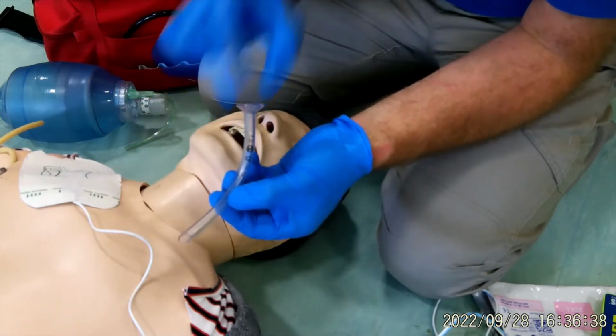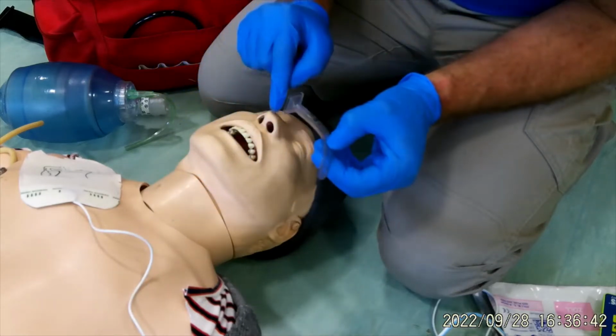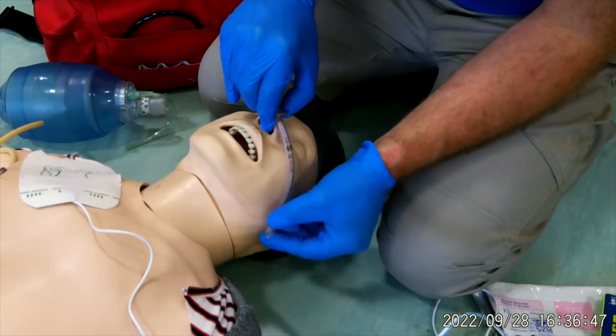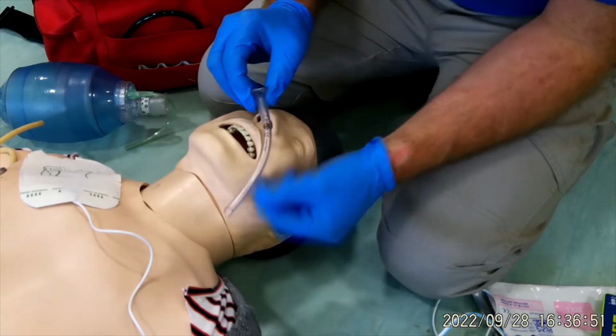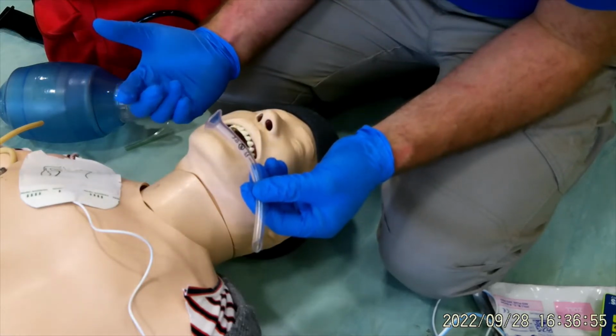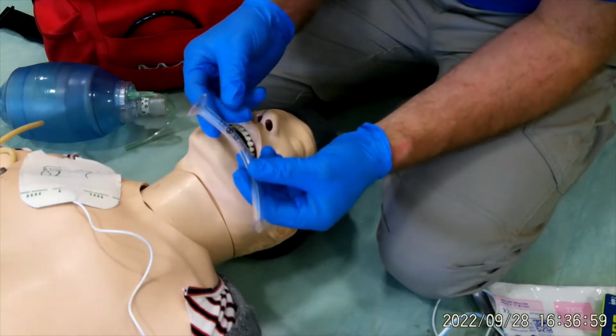This part is to stop it going right up the nostril. We measure it from the center of the nose, the point of the nose, down to the angle of the jaw, where we did the jaw thrust. And it's an estimate on this. As a general rule, a size 6, a smaller one, is for an average female, a size 7, an average male, but then we have got a larger one, a size 8.